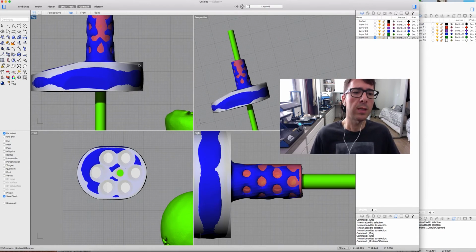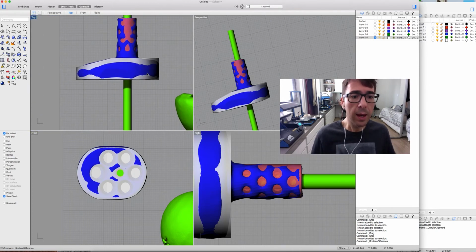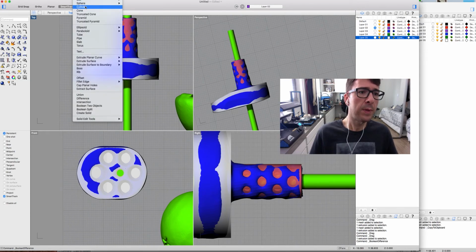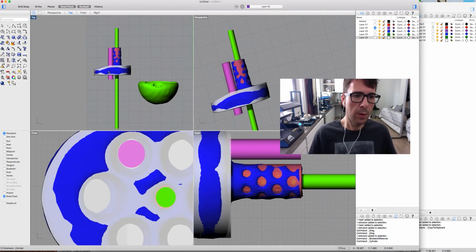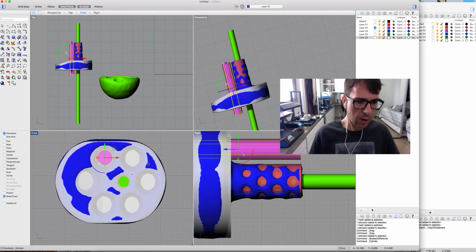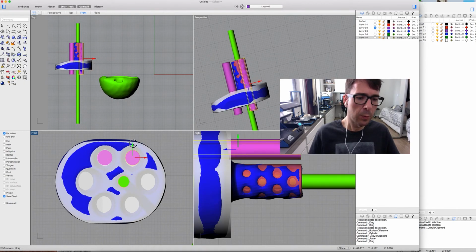Okay, we can do this with this part, but I'm not going to. This is very simple and very small. And here we almost have done our implant. If we want, we can draw the location for the screws. Okay, let's do it. Let's select another color, solid, cylinder, and let's zoom here, and let's draw a screw here. Once we have one screw position, it's just copy and paste and move to the location we want.